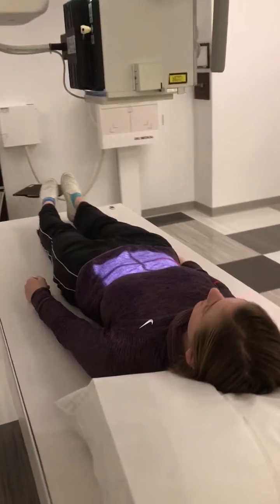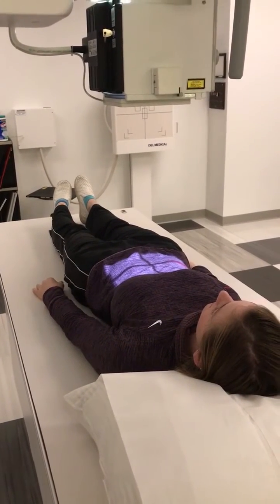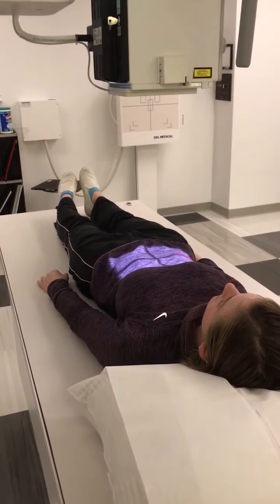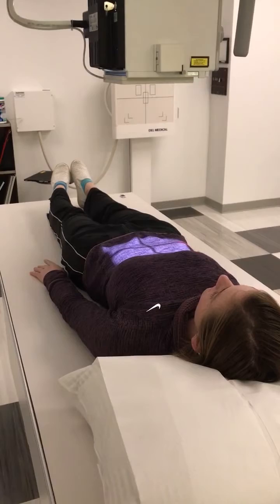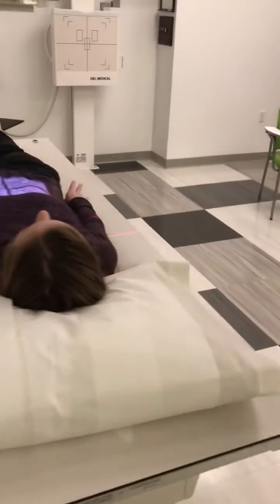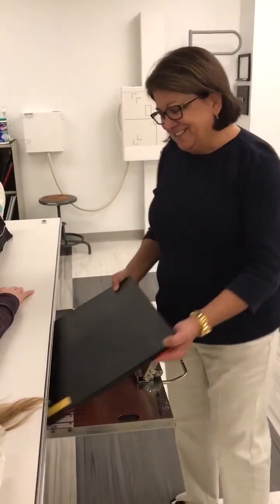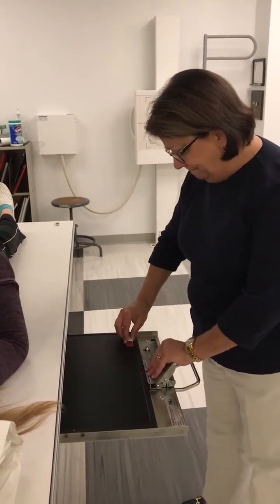Give you breathing instructions, ma'am. By this time, our contrast would be in the kidneys, filling the kidneys. Take a deep breath in, blow it all the way out, hold it out, exposure, you may breathe. So that's the nephrogram. So now we're going to perform the RPO and the LPO.